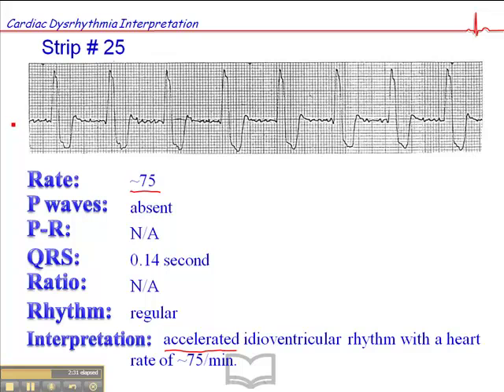This was actually taken from a patient I transported on a helicopter. I worked on an ARAMS helicopter for 10 years, and the first helicopter I flew on was a Bell 212, which is a very shaky aircraft. We used to call this Bell 212 artifact — that's just artifact along the baseline. So again, this is an accelerated idioventricular rhythm with a heart rate of 75.